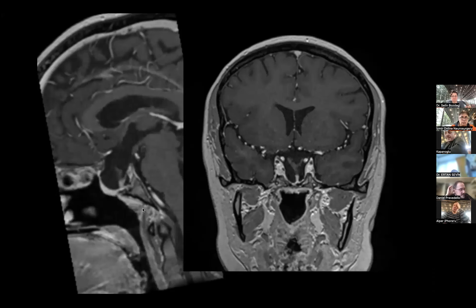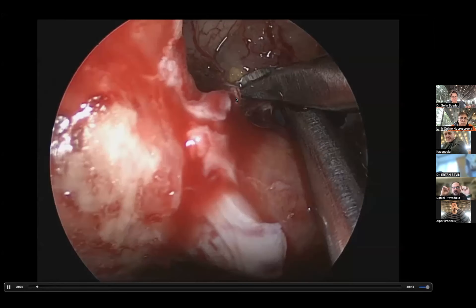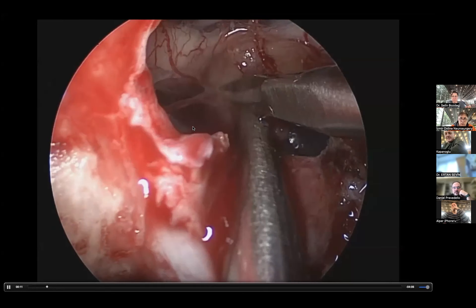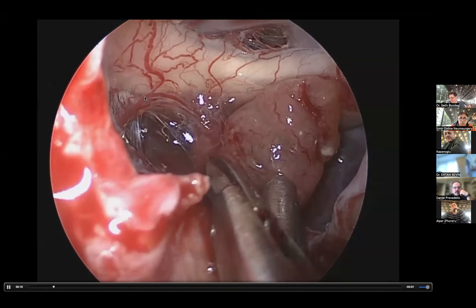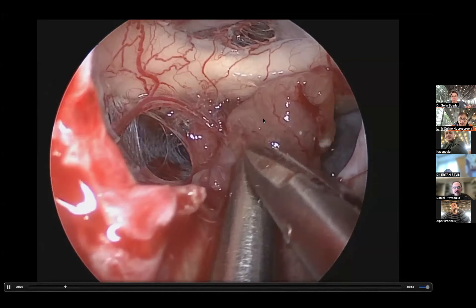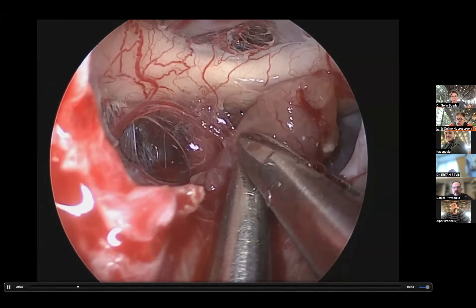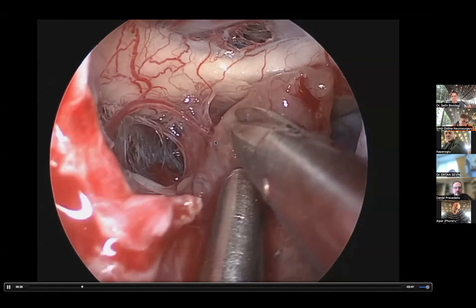For Type 0, where the tumor is in the sella, we perform a direct endonasal approach similar to resecting a pituitary adenoma. Type 1 is in front of the sella. With bimanual dissection using my suction, I can retract the tumor and present the arachnoid plane. You can see respect for the superior hypophysial arteries, the chiasm, and optic nerves on both sides. In this Type 1 case, we freeing those branches of the superior hypophysial artery very carefully.